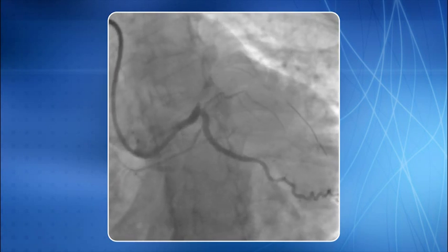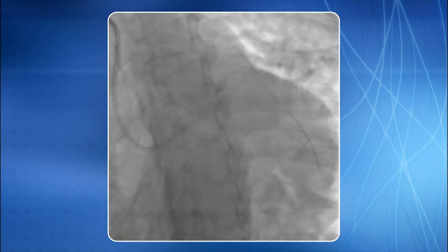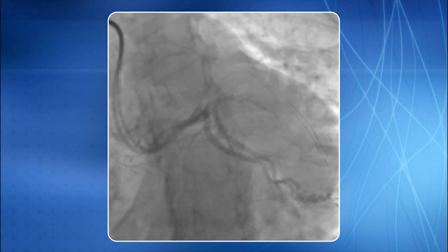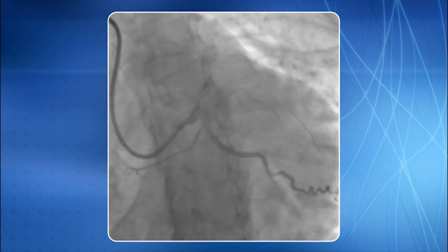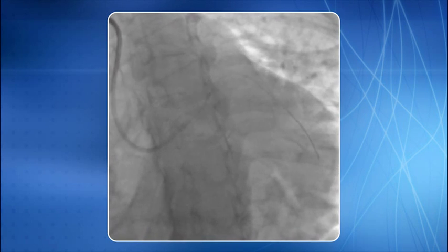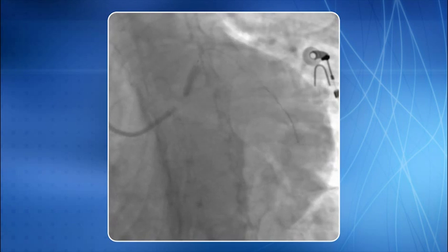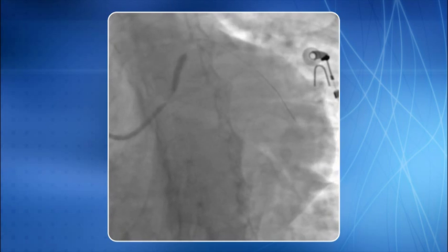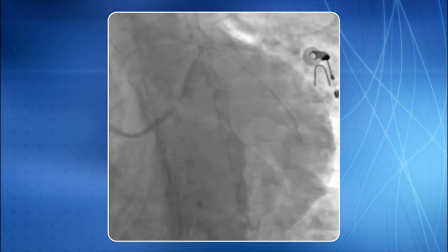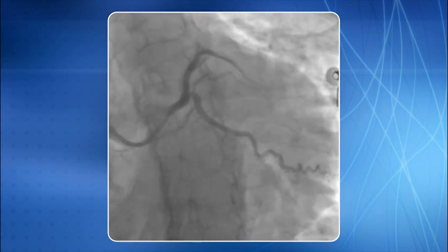The wire was parked in the distal LAD, ballooning was done, stenting is in progress, and this is an optimal end result.